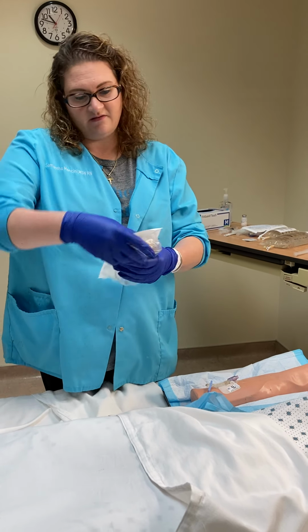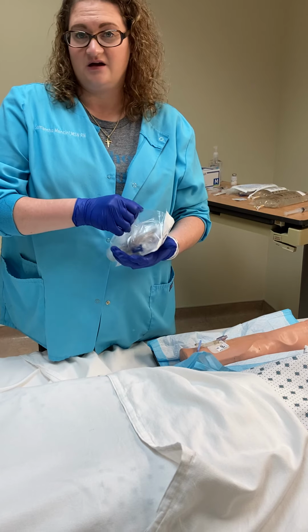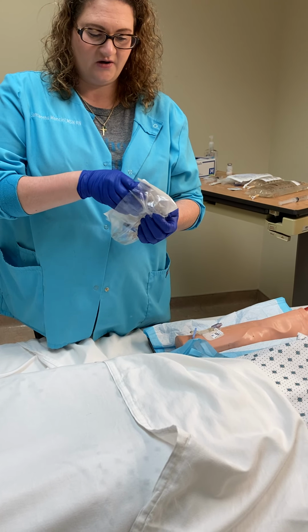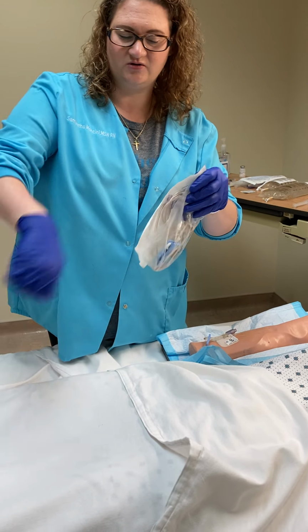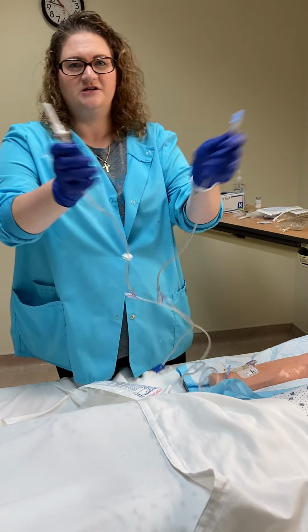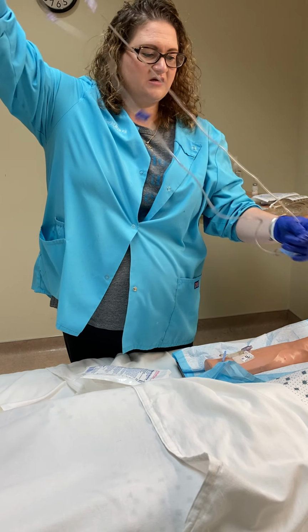Of course, we would want to look at our packaging, making sure that it's not expired, that it's not opened, that there's no tears or anything, there's no moisture. There's usually a little perforated edge. You just pull it on the side and you can take this out. You would want to make sure that the connectors are on there, because if they're not, you would get a new set of tubing.